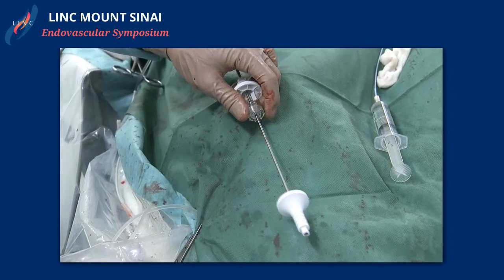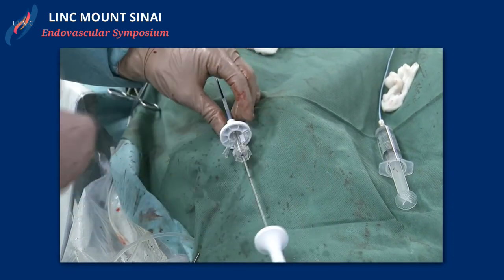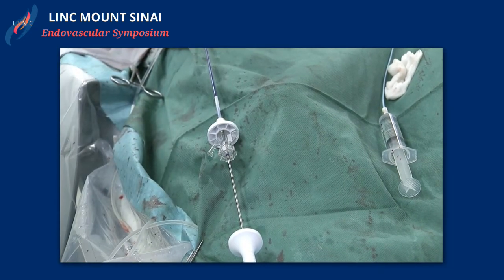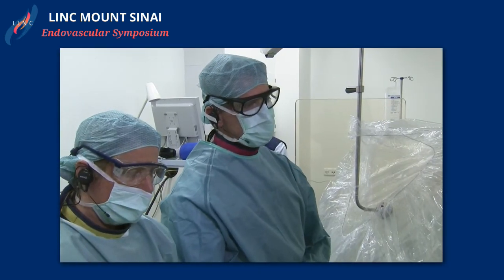And again, Andre, you're going to use the catheter that's up the right leg to be able to delineate the iliac vein confluence, so you can land the stent exactly at the origin of the common iliac vein. Is that correct? Yes, correct.